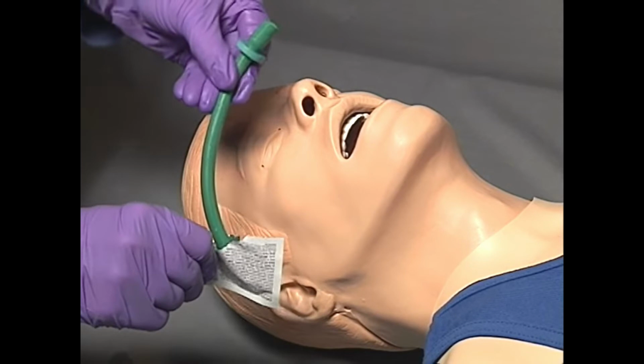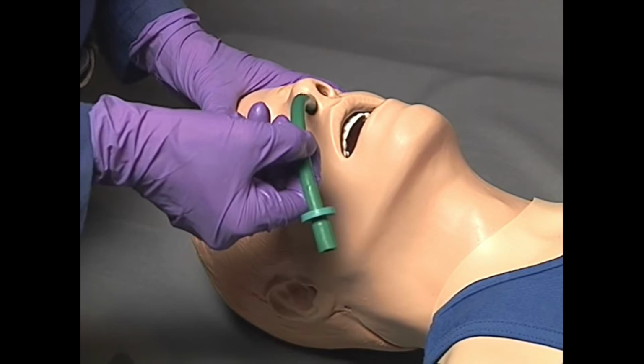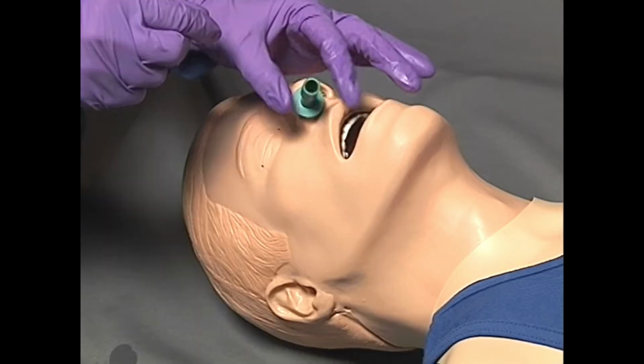Lubricate the distal surface of the airway with water or a water-soluble lubricant. If inserting the nasal airway into the patient's right naris, insert it so as to follow the normal anatomical curvature of the nasopharynx, with the bevel towards the septum. Direct the nasal airway along the floor of the nose into the oropharynx.